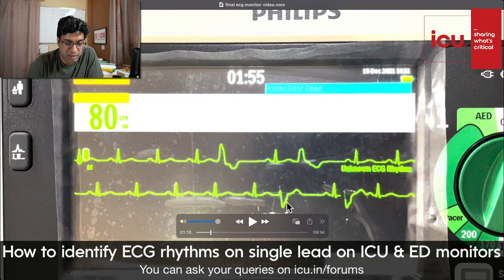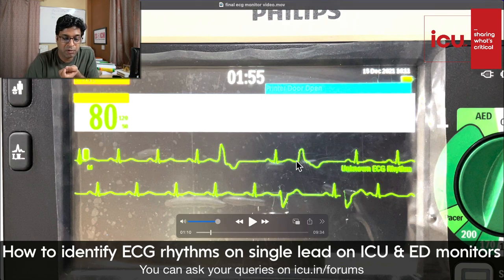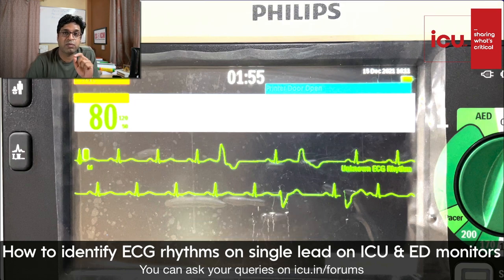One more PVC has come whose morphology is different from the previous two. It means the ventricular PVCs are coming from multiple areas, not from a single point in the ventricle. So they are called multifocal premature ventricular complexes, multifocal PVCs. You got my point? They are originating in the ventricle, so they are a broad complex. They are coming prematurely before the next beat, therefore premature.